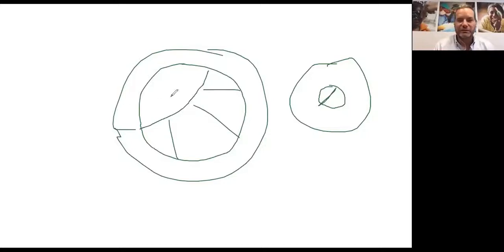Now eventually, maybe that lens is totally out of the way or comes loose. If it comes into the anterior chamber, you can lens loop it out. If it floats into the vitreous, it doesn't hurt anything as long as the lens capsule is intact. So if I didn't have a vitrector, that would probably be my approach to a patient like this. All right, and let me go back to our questions.